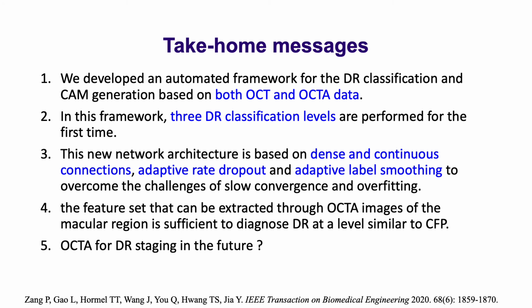Our study also shows OCTA is sufficient to diagnose DR at a level similar to fundus photo. So in the future, we might want to consider OCTA for DR staging.